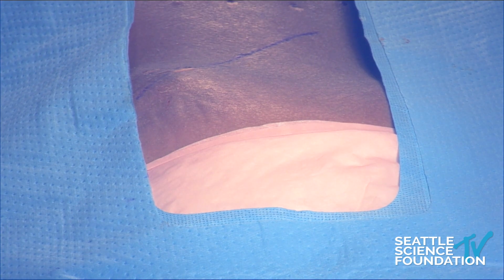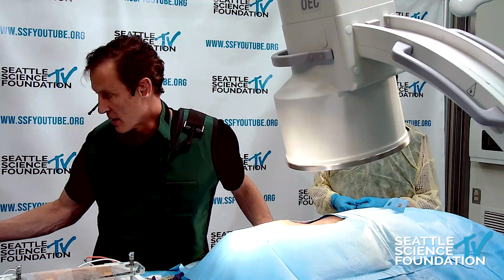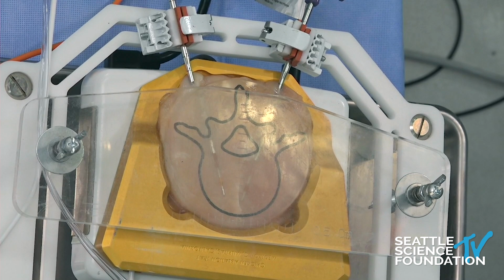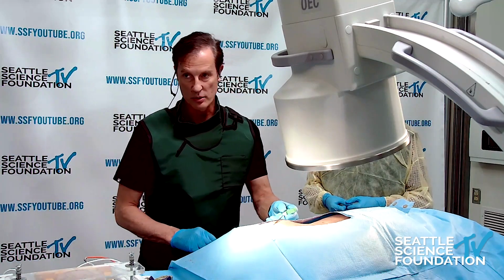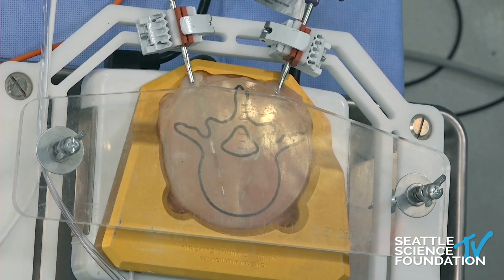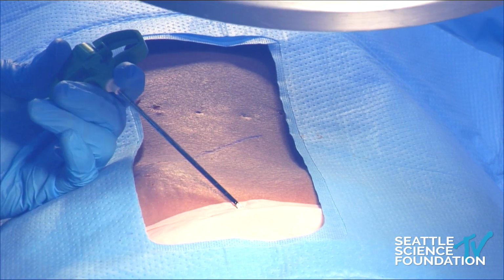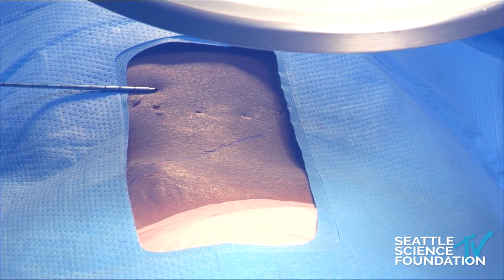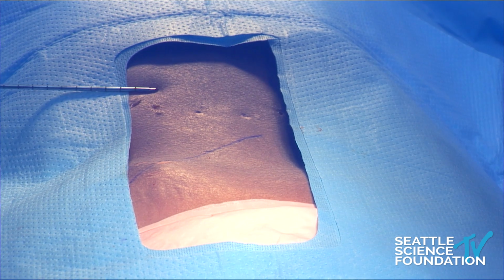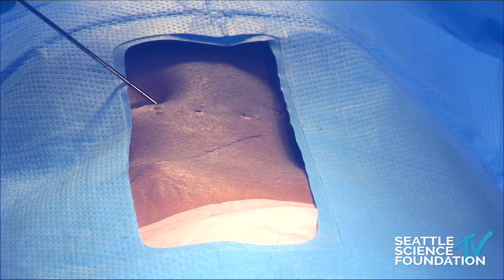Okay. All right, we'll use this. We're going to keep burning, and we have about 13 minutes and 6 seconds. I'm going to go on to the last demo that we have here, the SpineJack. Amanda will give me the introducer needle. The introducer needle is a typical 11 gauge needle. And this is it. We're going to use a transpedicular approach. I'll go just above where we were, so come up superior a little bit, very good. This is a transpedicular approach, a centimeter up, 2 centimeters out, and making an incision.